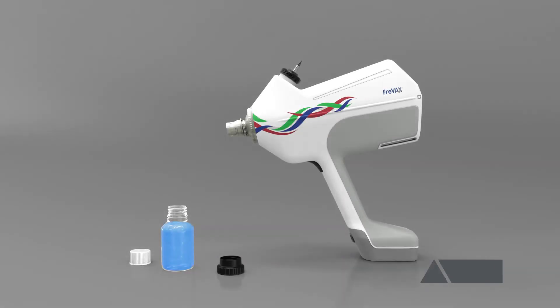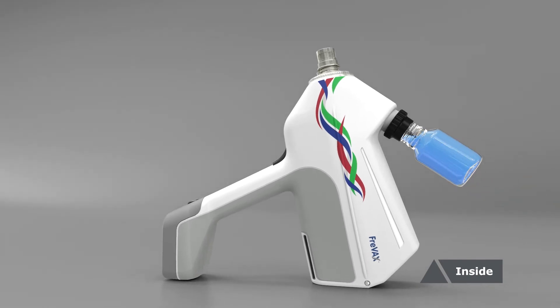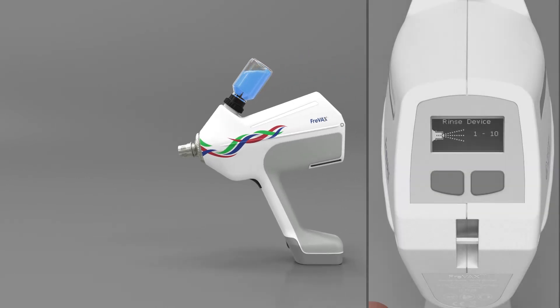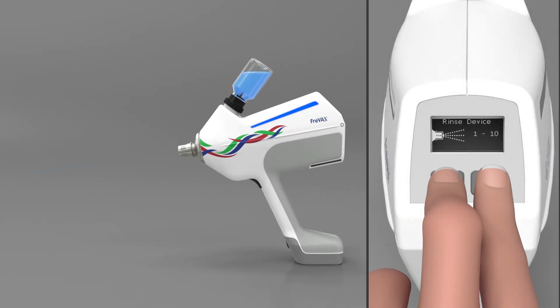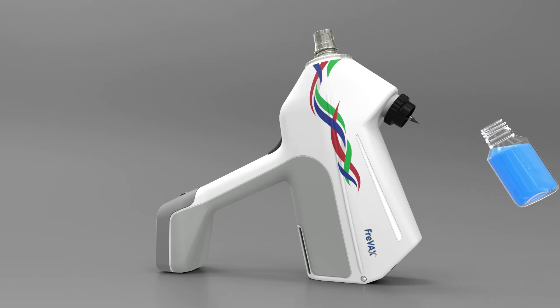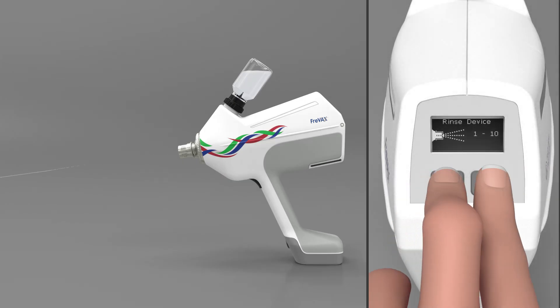For a long service life, we recommend cleaning the Freevax after each use. Cleaning is done in two steps: first from the inside, then from the outside. To clean your device from the inside, connect the 100 milliliter PET bottle filled with the predefined cleaning fluid to the device. Start the integrated rinsing program by pressing the two display buttons simultaneously for three seconds. The device will rinse itself 10 times automatically. Afterward, refill the PET bottle with clear distilled water and start the rinsing program again to rinse out residues of the cleaning fluid.